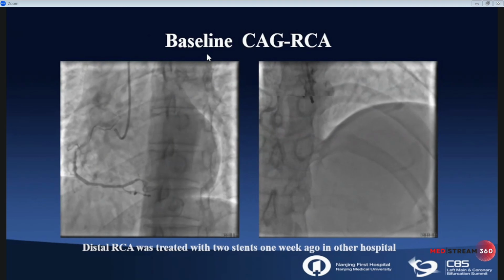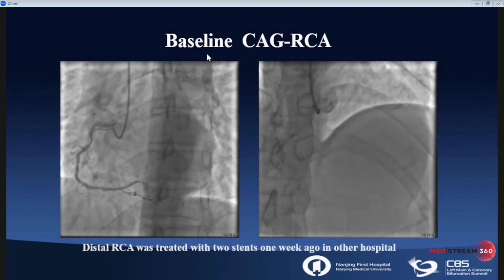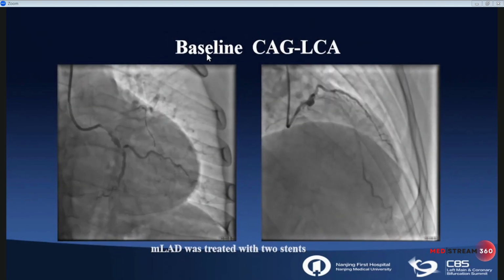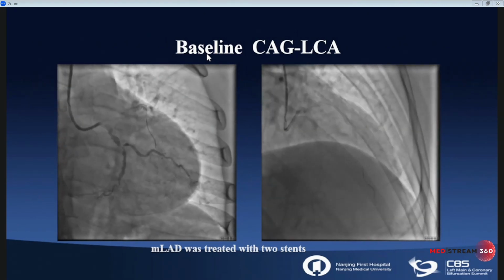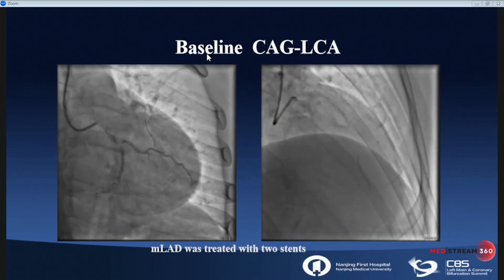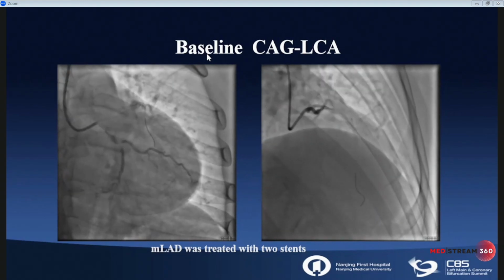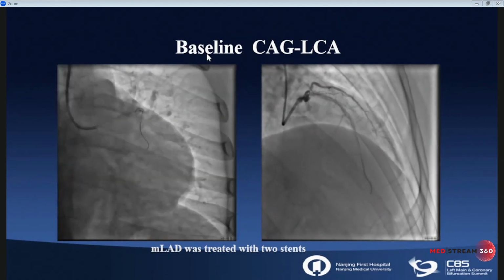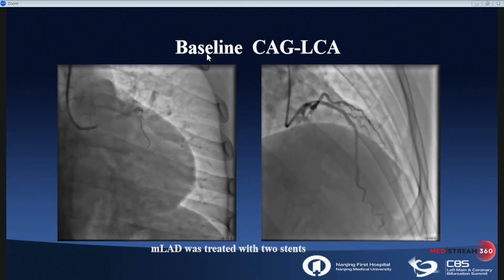So okay, it's your turn now. Could you calculate the risk stratification of this case before the procedure? After performing successful PCI for the RCA and the LAD, today we will focus on the circumflex lesion combined with the OM1 circumflex bifurcation lesion, 2 bifurcation lesions with OM1, and the distal circumflex may also be a bifurcation lesion. We cannot see it clearly because there is a subtotal occlusion.